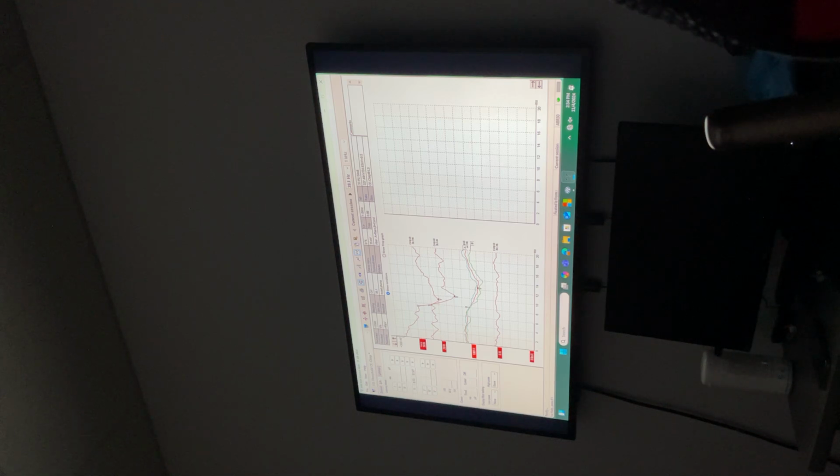So let's go to narrowband. When we're checking behavioral, do we just go to 0 and below? Or no? This one there in the booth, yeah. Oh, in the booth, okay. Yeah. You're not doing any behavioral with this, even for the tone burst control.